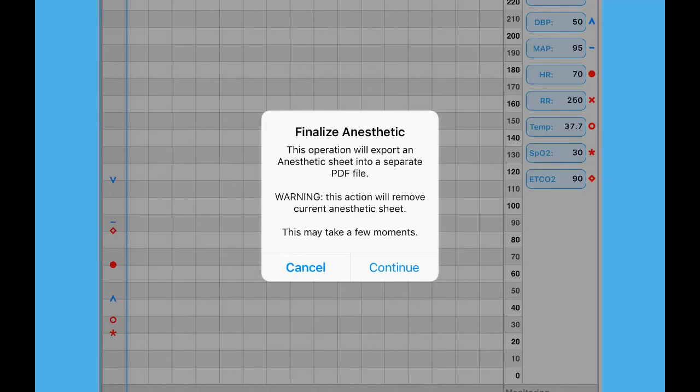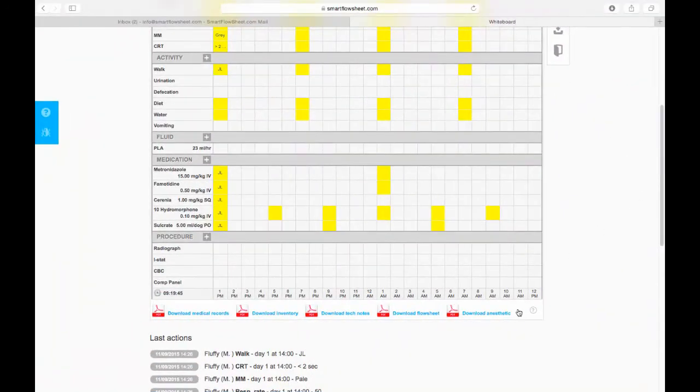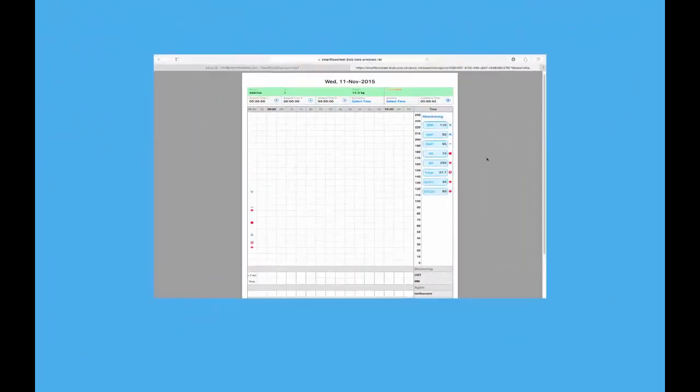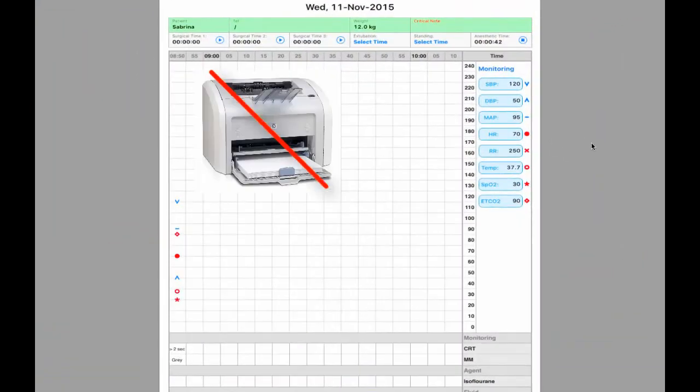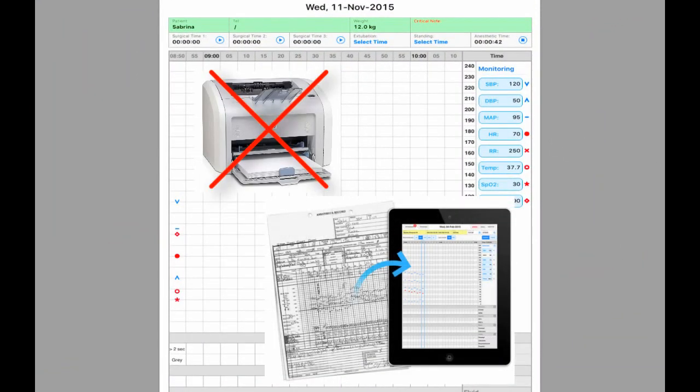You will then receive a copy of the anesthetic form upon patient discharge or you can access the record on the web as a PDF. And just like that, no more printing and no more sloppy records.